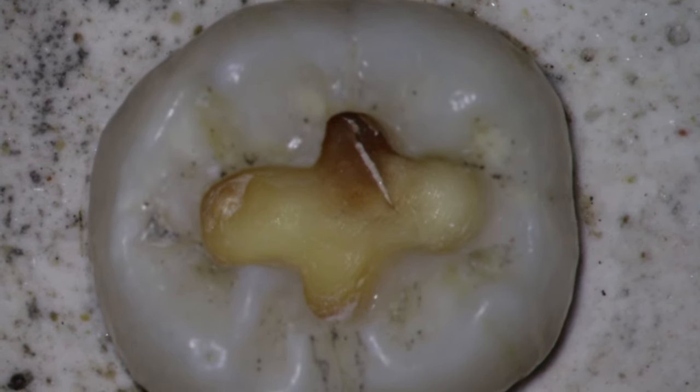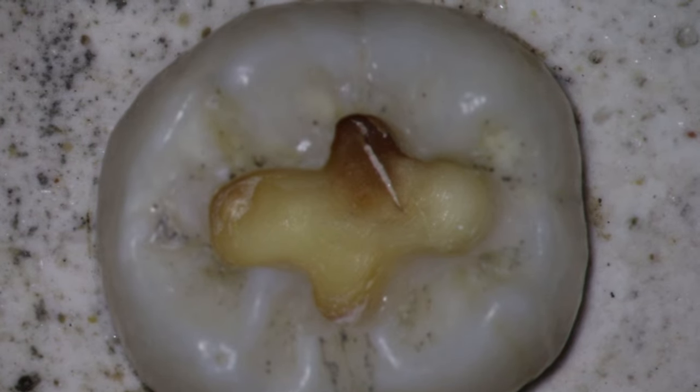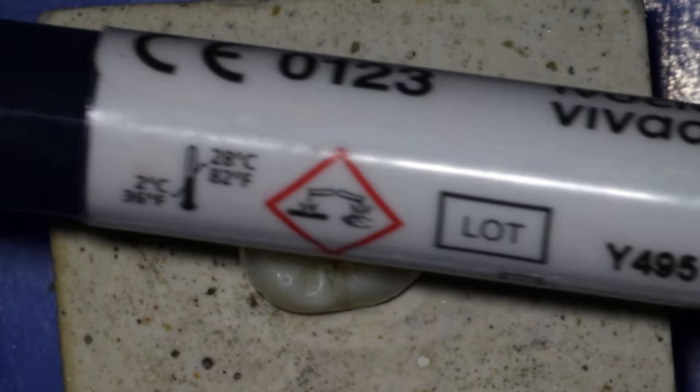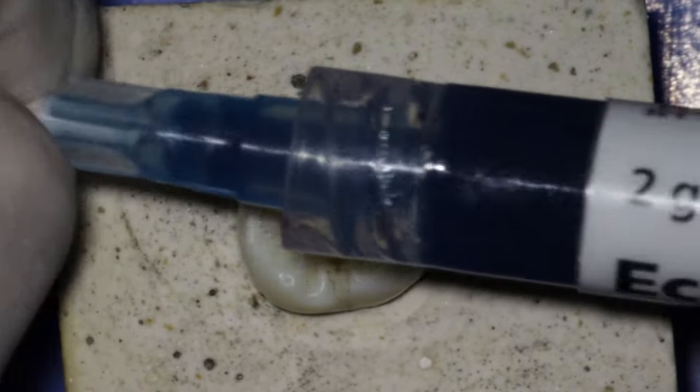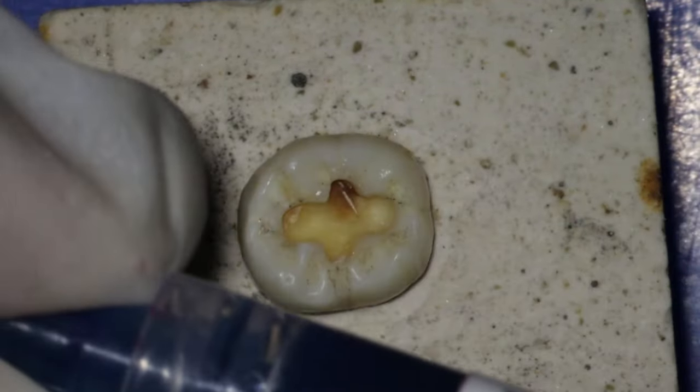It depends on which type of bonding you are doing, and today I am going to teach you the fifth generation bonding technique, where you have the total etchant application followed by bonding and then composite restoration. So this is an etchant, generally it is blue color, and you can see it is written 37% phosphoric acid.